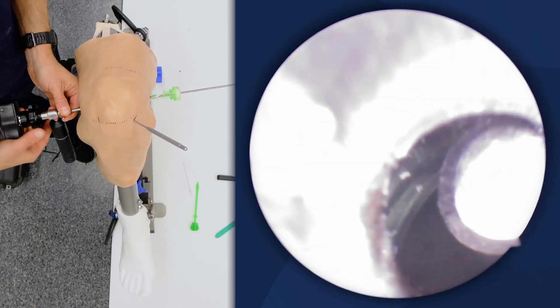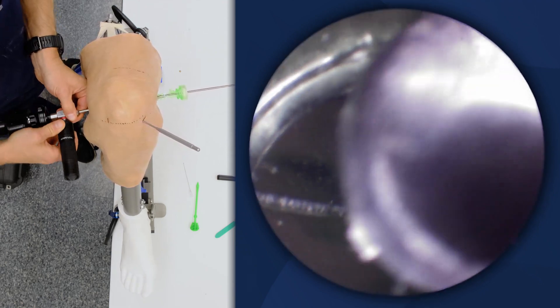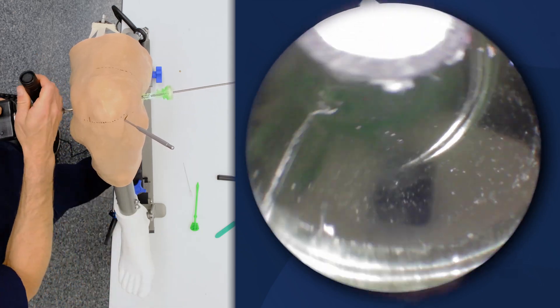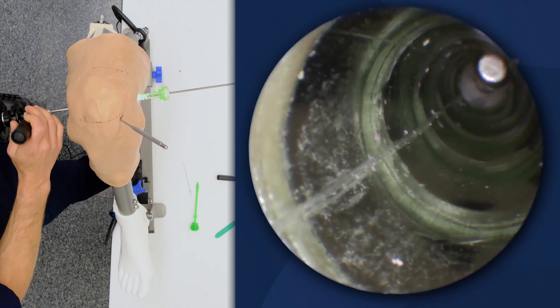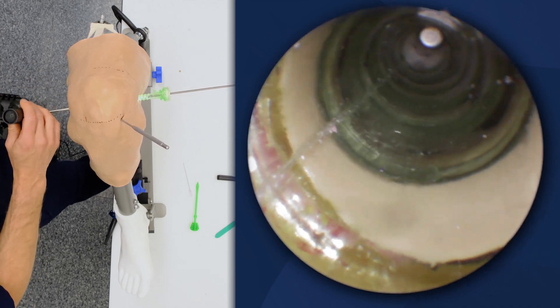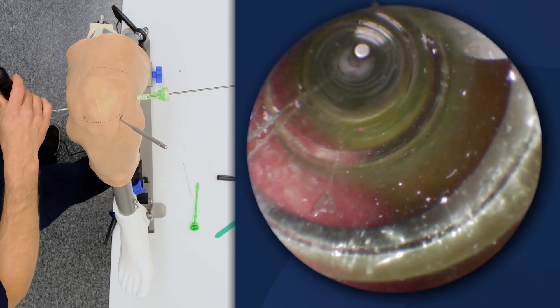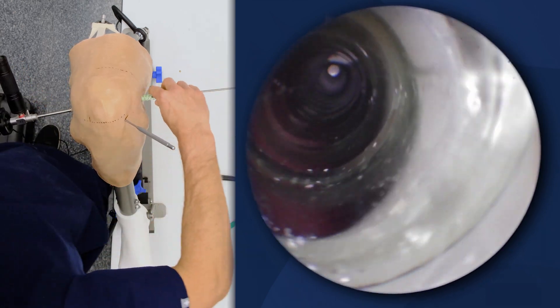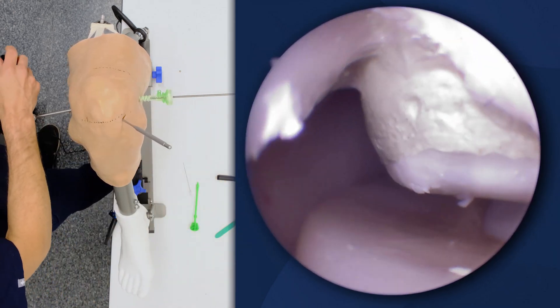Now I can see the cannula and the trocar. I'm taking away the scope and removing it from the inside part of the cannula, and now I'm looking at the medial aspect of the knee from the posterior approach.